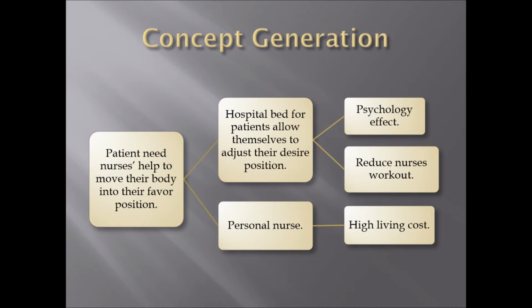The latest model hospital bed can be raised and lowered at the head, feet, and its entire height. Raising the feet can help easier movement of the patient toward the headboard and may also be necessary for certain conditions. Raising and lowering the height of the bed can help bring the bed to a comfortable level for the patient to get in and out of the bed.